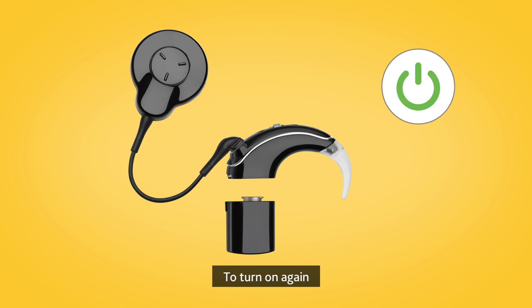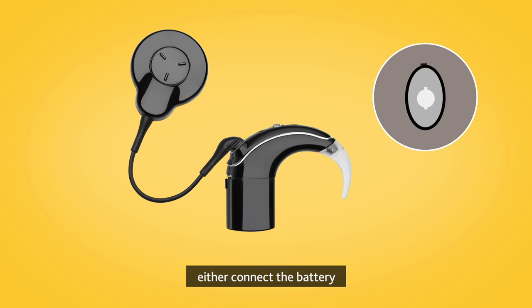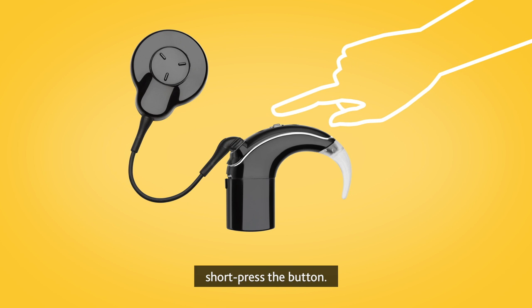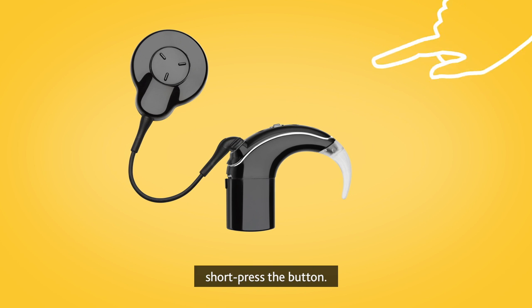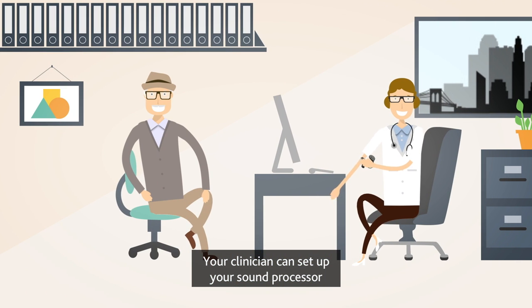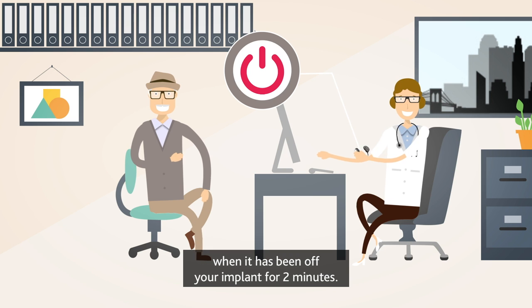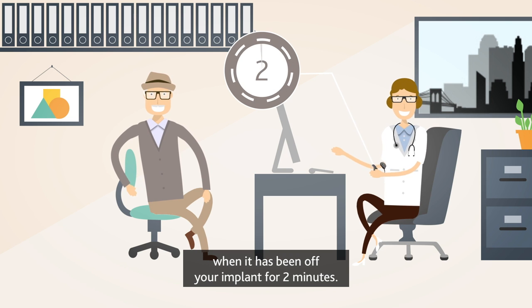To turn on again, either connect the battery, or if the battery is already connected, short press the button. Your clinician can set up your sound processor to turn off automatically when it has been off your implant for 2 minutes.